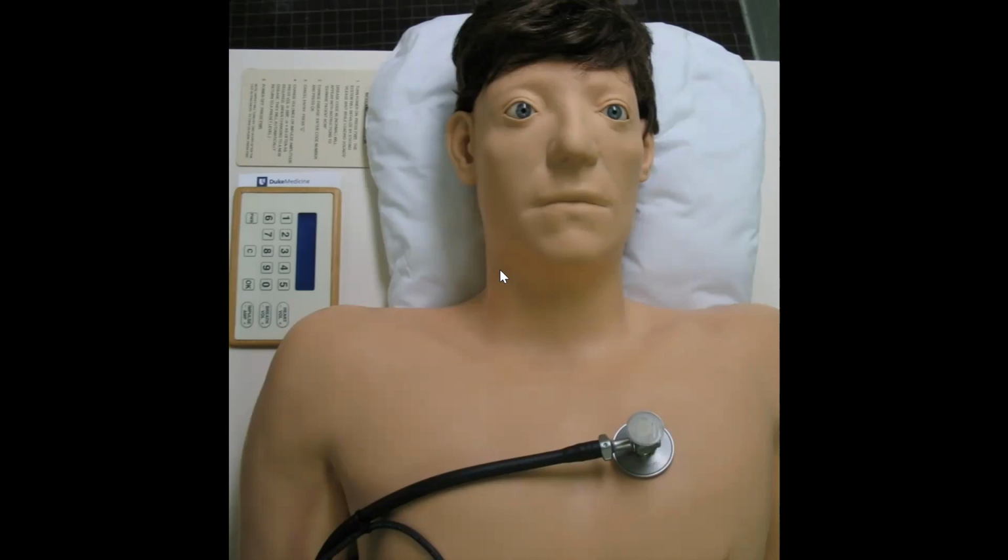And you will start with A for airway. I will verbalize that as my patient is alert and conscious, the airway is patent. I would like to give my patient 100% oxygen via non-rebreather face mask, 15 liters per minute, after ruling out COPD, because a COPD patient should not be given 100% oxygen. Then you will pick the face mask and go to the patient. Tell him, I would like to give you some oxygen to relieve your breathing. Do you have any smoker's cough? No, doctor. Okay. And very gently, you will put the face mask on the Simman.